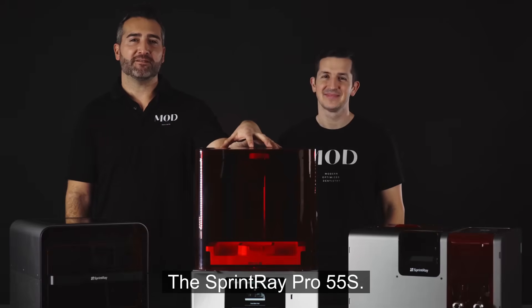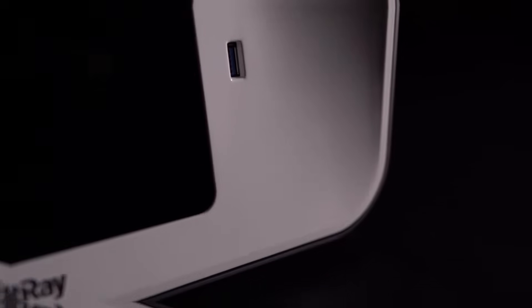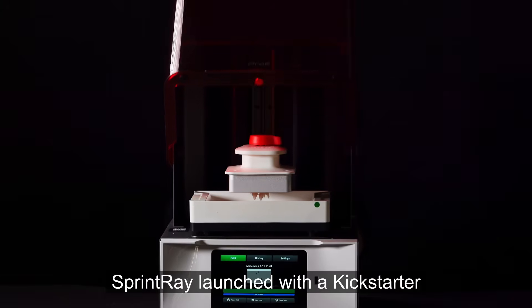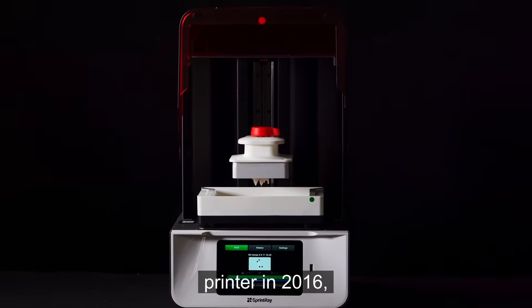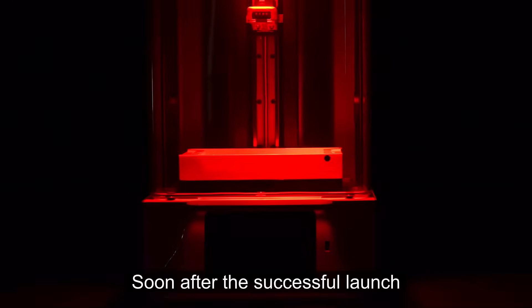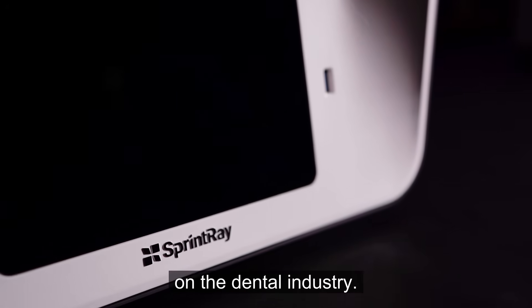The Sprintray Pro 55S. Let's get into it. Sprintray launched with a Kickstarter campaign for their innovative Moonray printer in 2016 — a printer designed to take digital light projection technology to the masses. Soon after the successful launch of the Moonray, they decided to completely focus their efforts on the dental industry.